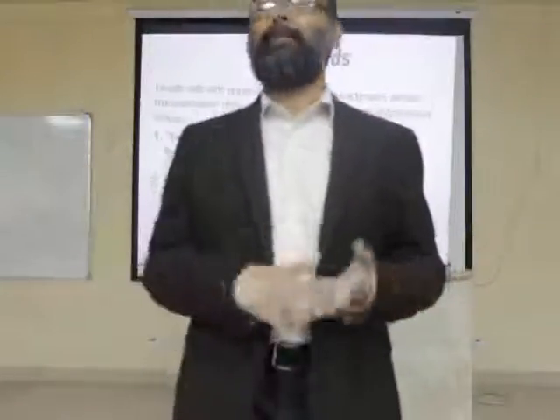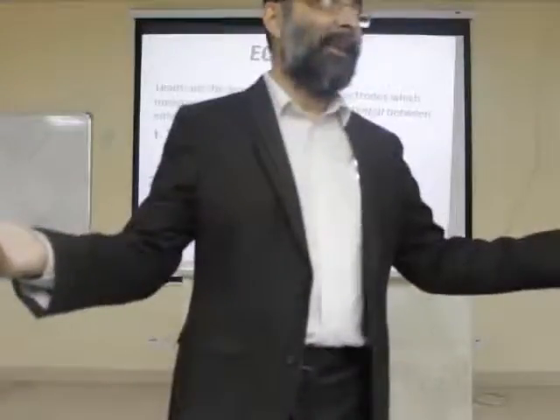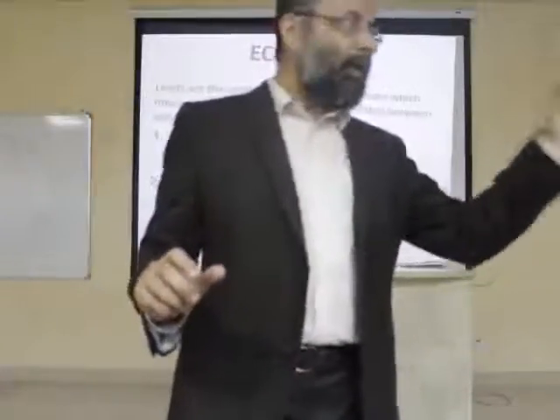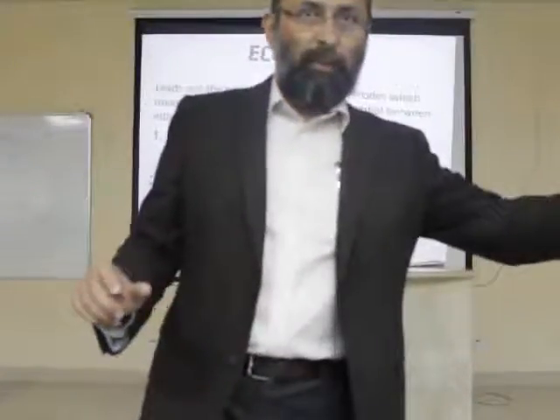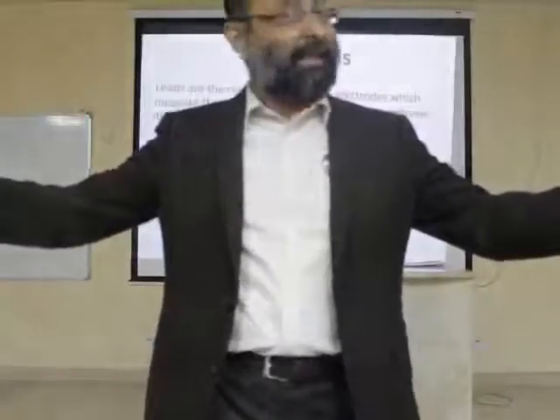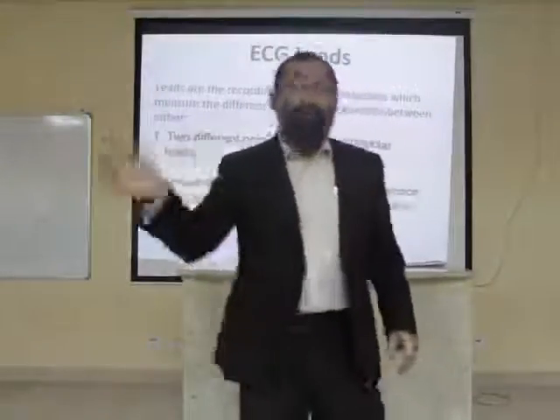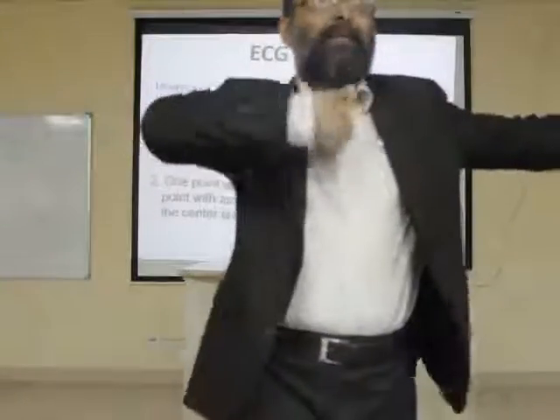No, if it is negative, then it becomes the bipolar system. Yes, it is neutral or zero. So if you are recording something between 0 and the positive, then this system will be unipolar. Which system should be more powerful in the flow of current, from positive to negative or positive to 0? Sure, this is positive, this is negative, and somewhere here it is 0.